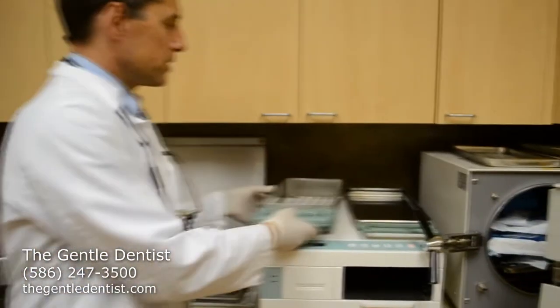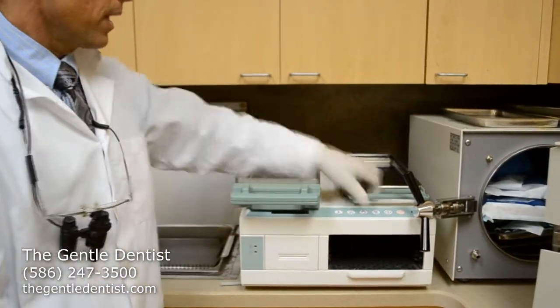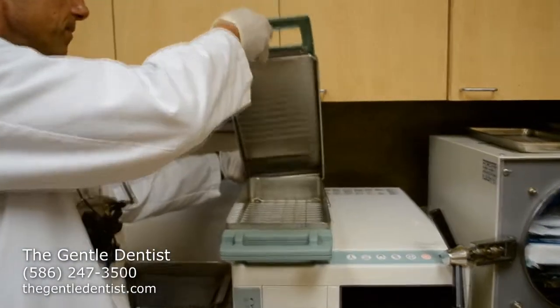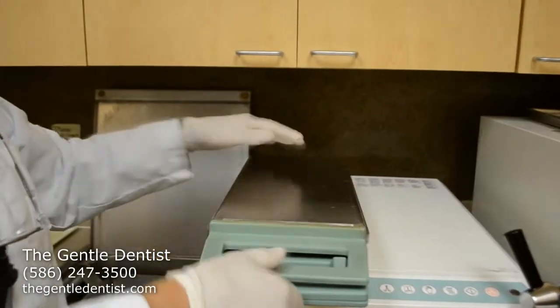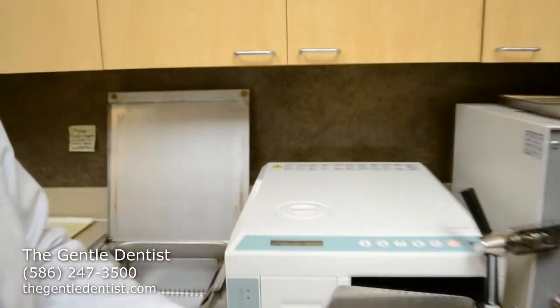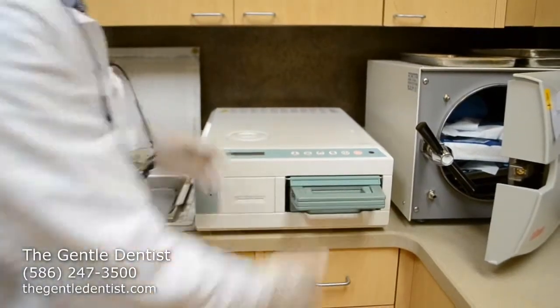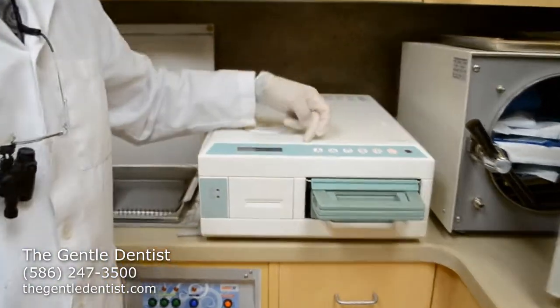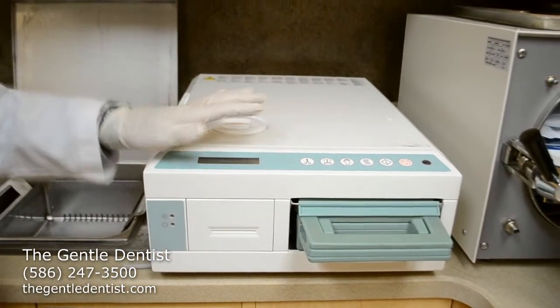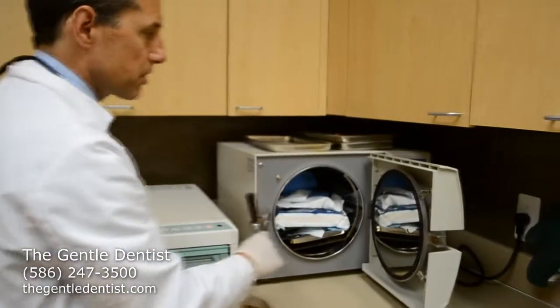A Statim is used to process instruments pretty quickly. This cassette fits in here. It goes down, we put instruments inside, it comes over the top, and then this fits inside of here. At that point, we select what mode we want to use, and it goes through it pretty quickly.